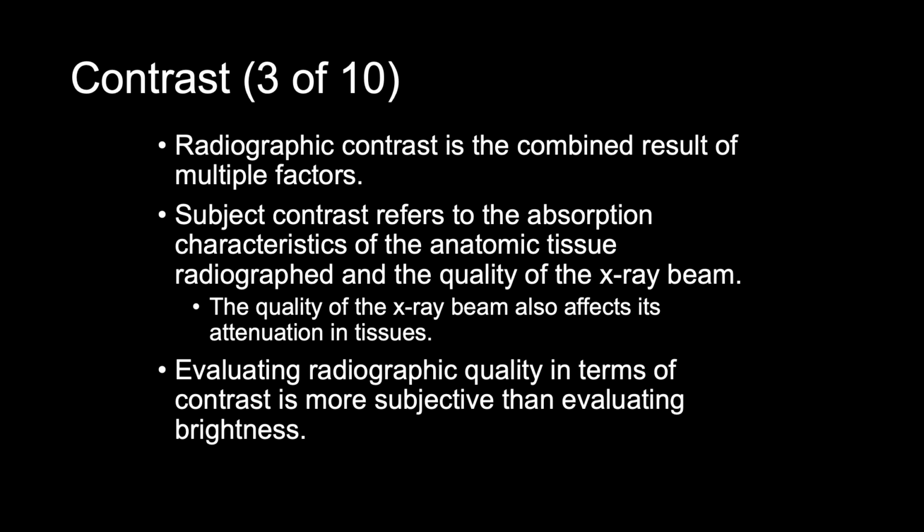Differences in the tissue thickness, the tissue density, and effective atomic number contribute to the subject contrast. The level of radiographic contrast desired in an image is determined by the composition of the anatomic tissue that's being radiographed and the amount of information needed to visualize the tissue for an accurate diagnosis. Evaluating radiographic quality in terms of contrast is more subjective than evaluating brightness.